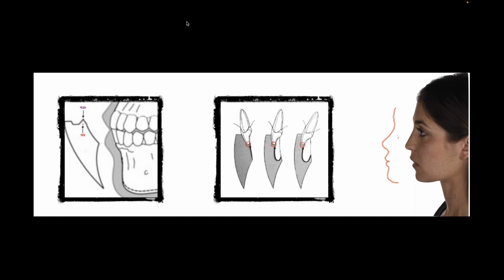What I'm really looking to do is create space and room in there, so I make sure that I could pull maybe 15, 20 microns through there for many reasons. And that's really not just to create a constricted envelope, but my lower teeth are hitting on my restorative uppers, or even the natural uppers for that matter. Yes, I still work anterior guidance, a topic for a different day, although I have a different concept on that too.